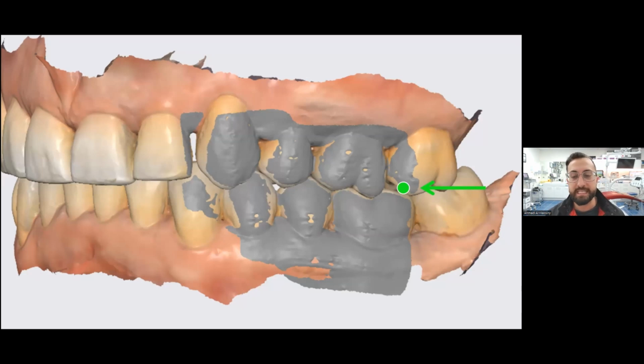Usually around the 6s is enough, around the 7s. And you want the scanner to be basically facing the occlusal table, perpendicular. And what you then do is you move forward, you move anteriorly, with an almost bodily movement of the scanner up and down as you move anteriorly. The reason you do that is in that little window of the scanner, you want to capture both the upper and lower teeth while they're in occlusion, and also 1 millimeter, 2 millimeters of the gingival tissue, because that is going to give you your most accurate bite scan.